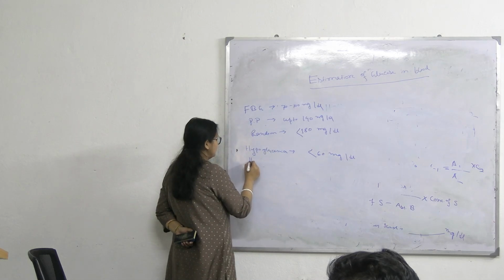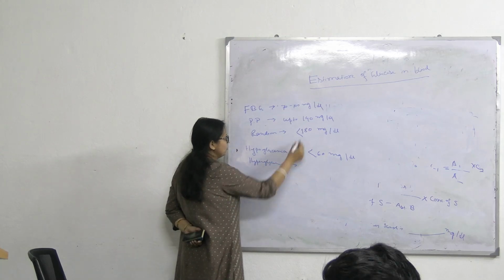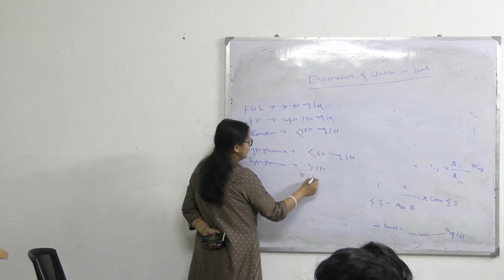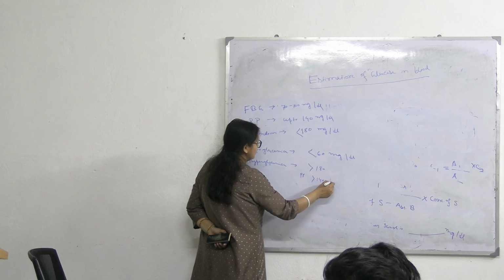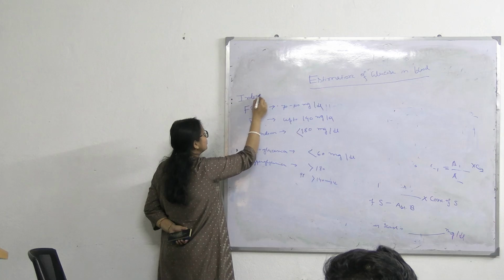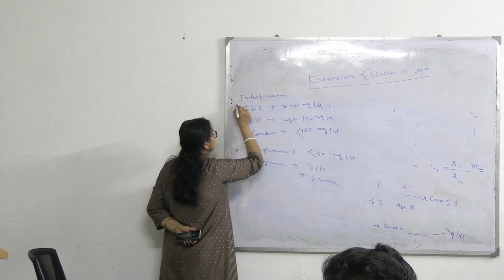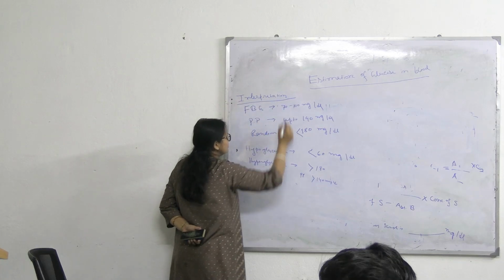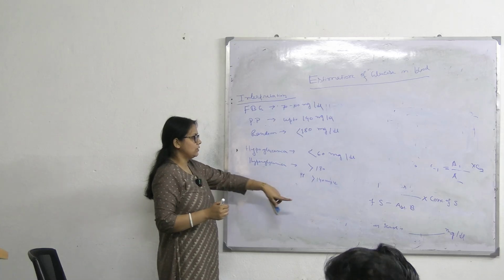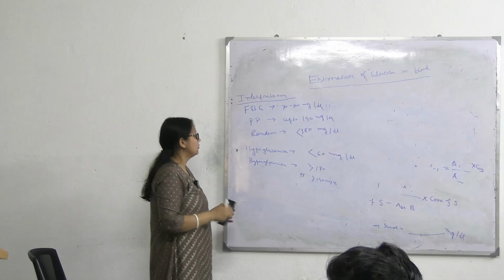And hyperglycemia, if random blood glucose level is more than 180 or postprandial is more than 140, okay? Okay, this is your interpretation. You have to write all this, and at the end the value যেটা আসবে, so the sample is hyperglycemic or hypoglycemic, you have to mention, okay?